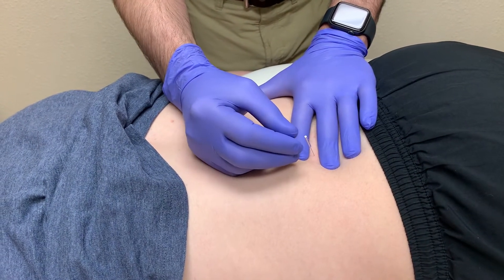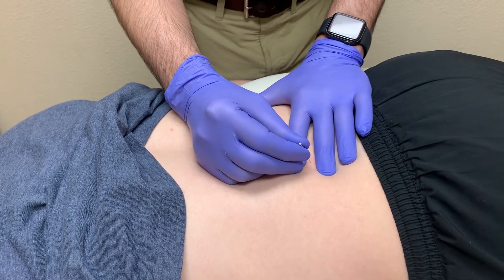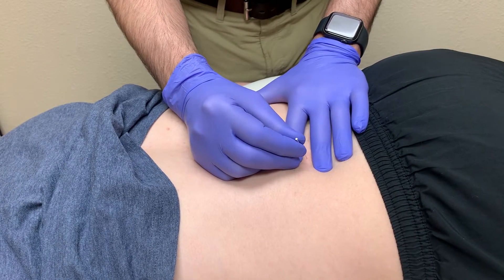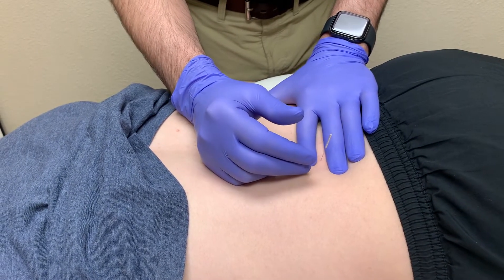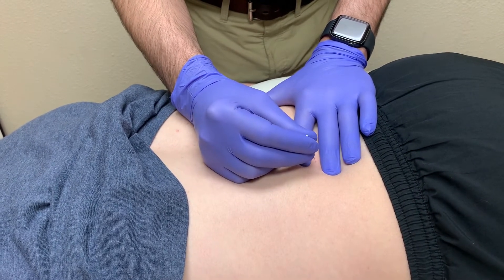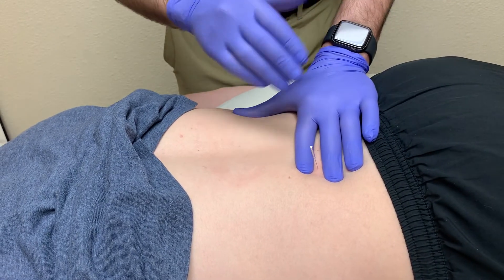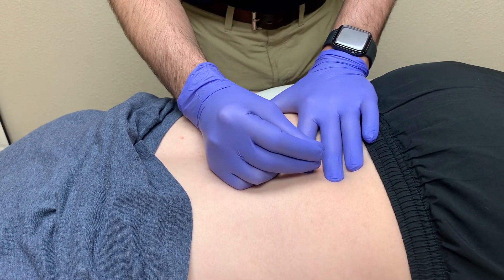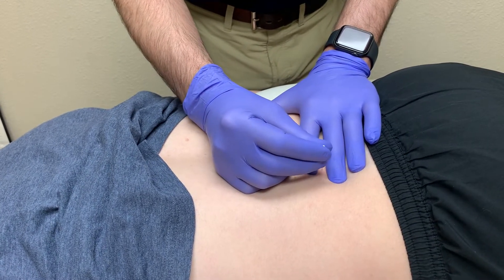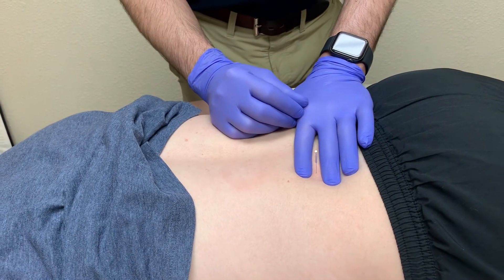One thing we'll talk about more at the on-site course is we can slow down the speed of our pistoning so it's no longer fast in and out — it's a little bit slower in and out. You can also change the angle, but one of the advantages of going a little bit slower is you can detect when you're going from one layer of muscle to the other, when you're going through fascial layers, and you can get a better end feel for the resistance of the tissue and the reactivity of the tissue. That tends to really help cut down on some of the post-treatment soreness.